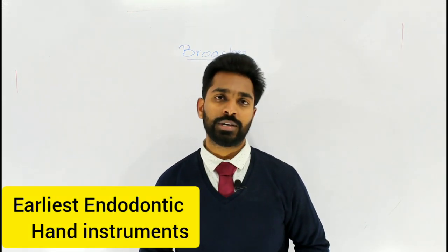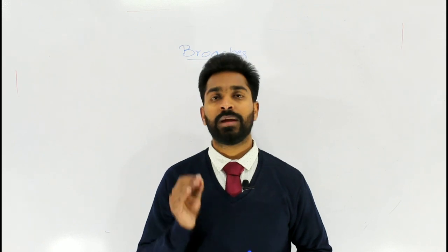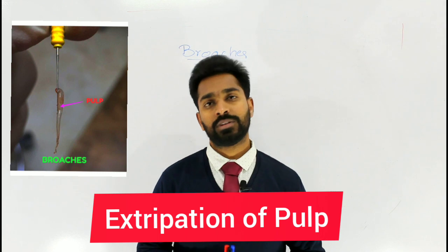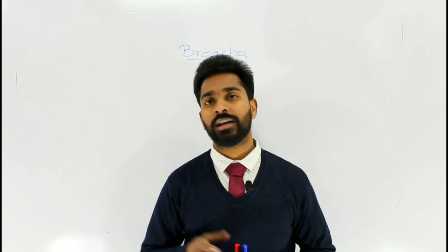Broaches are the earliest endodontic instruments, hand instruments, used for the extirpation of the pulp and for enlarging the root canal. The main function of the broach is to extirpate the pulp from the root canal, and other minor functions include removal of absorbent points, cotton pellets, other foreign materials, and necrotic debris.